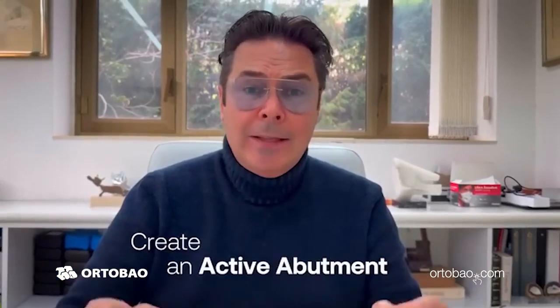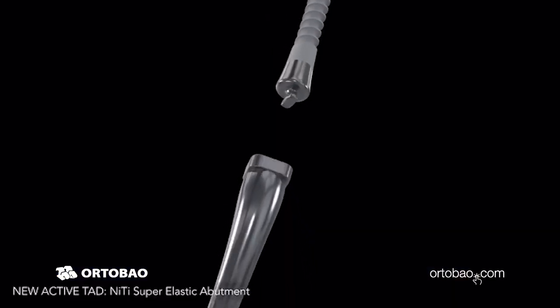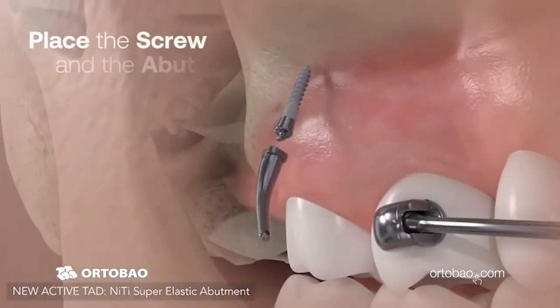How can we turn upside down the way the TAD works in orthodontic treatment? What we have done is to create an active TAD, an active abutment for bone-anchored devices. That means we place the screw and then we place an abutment.